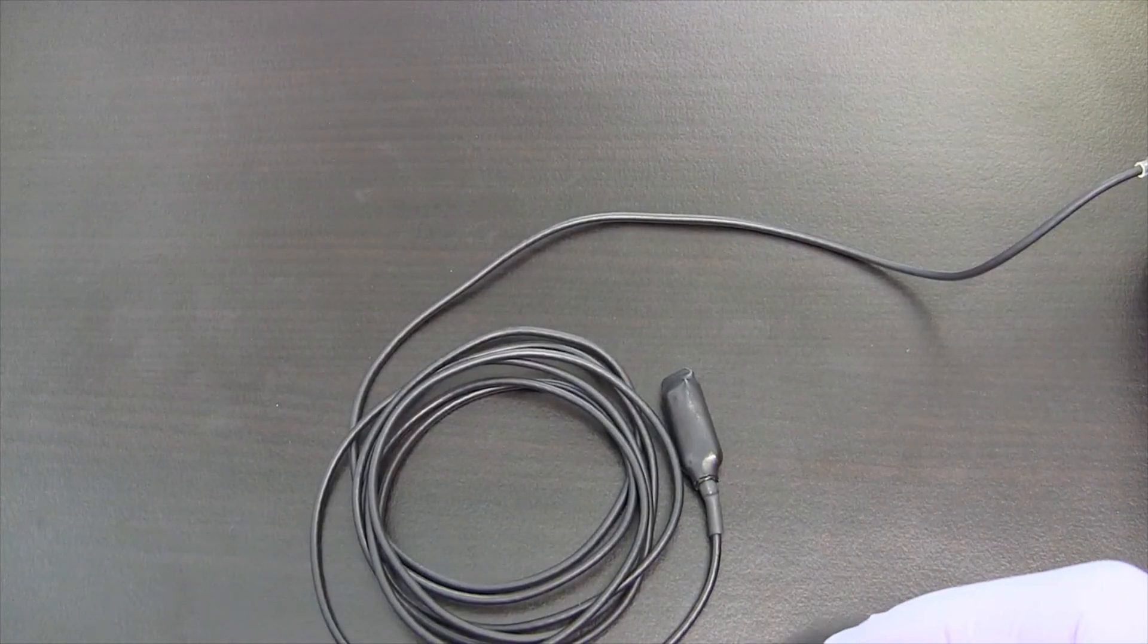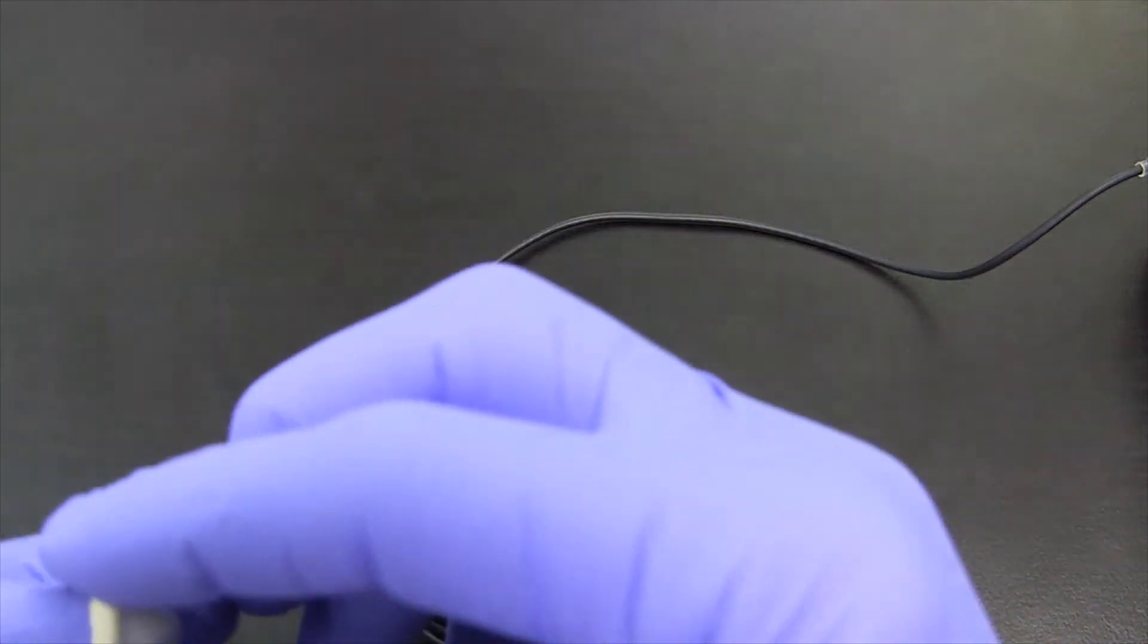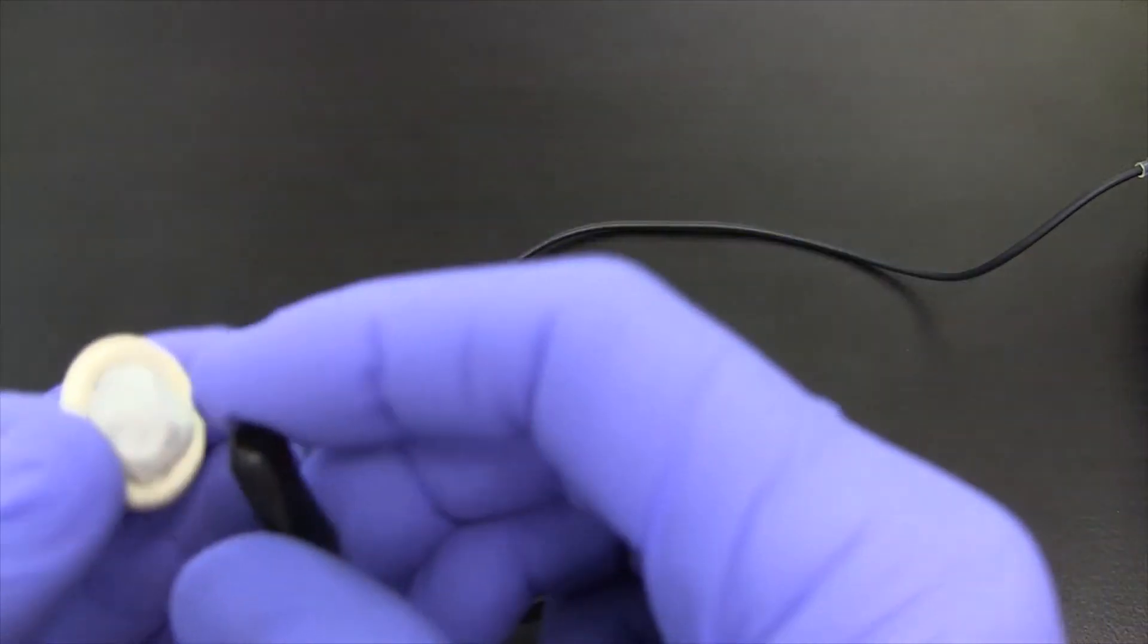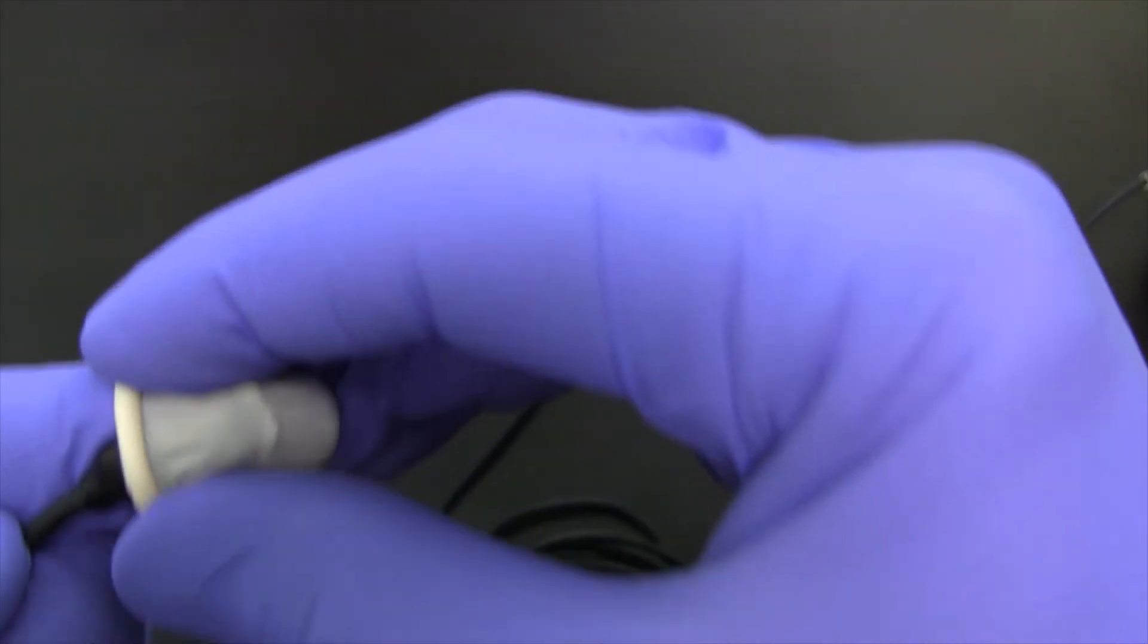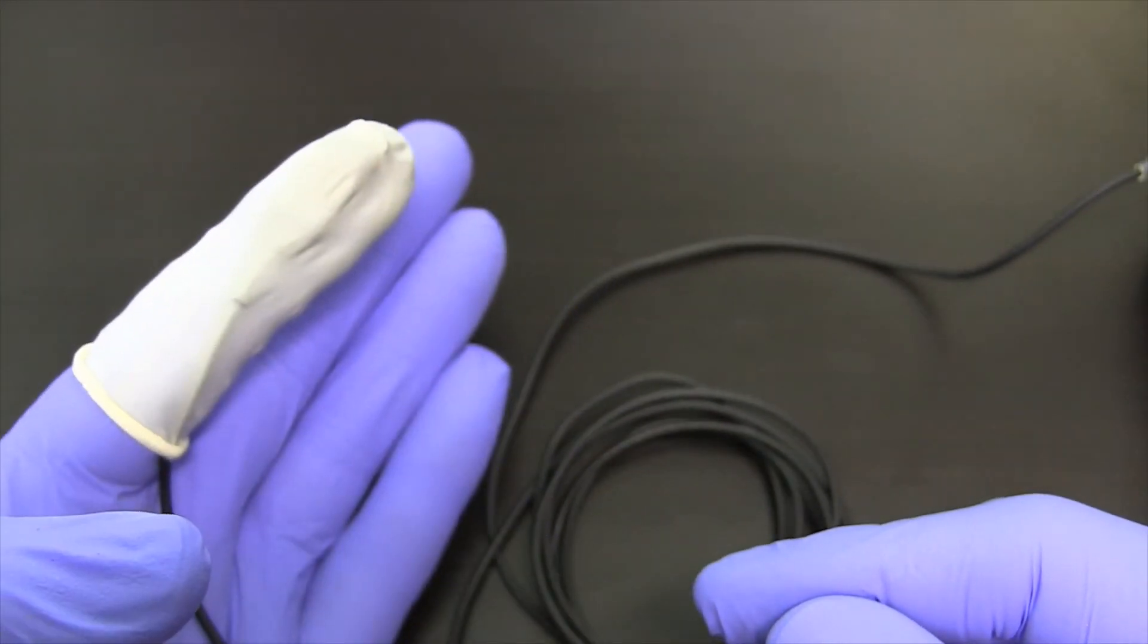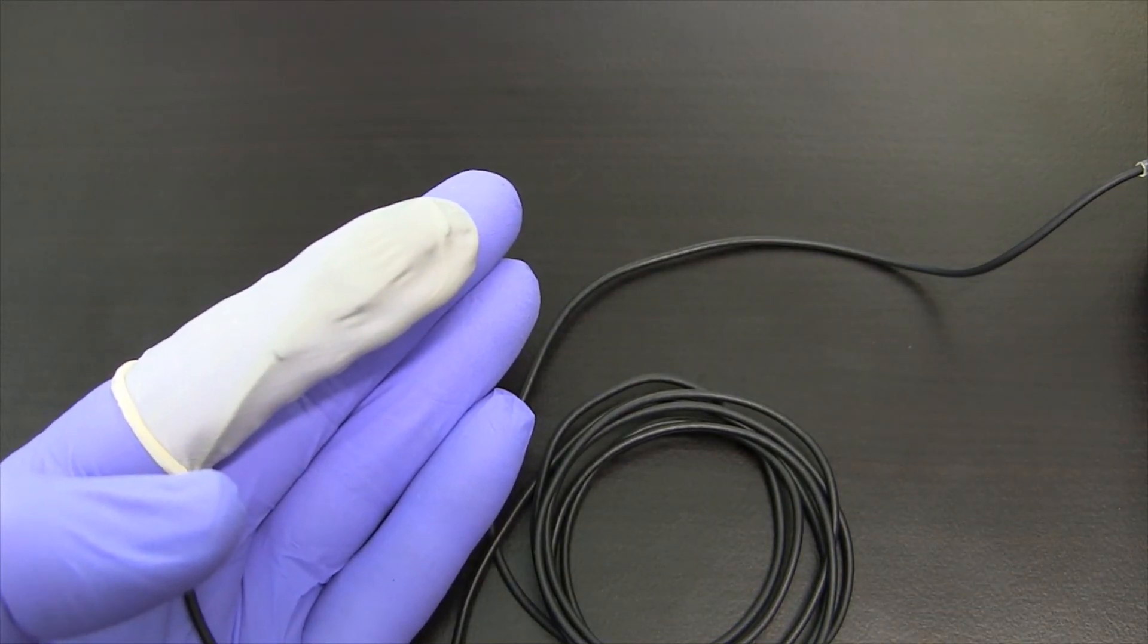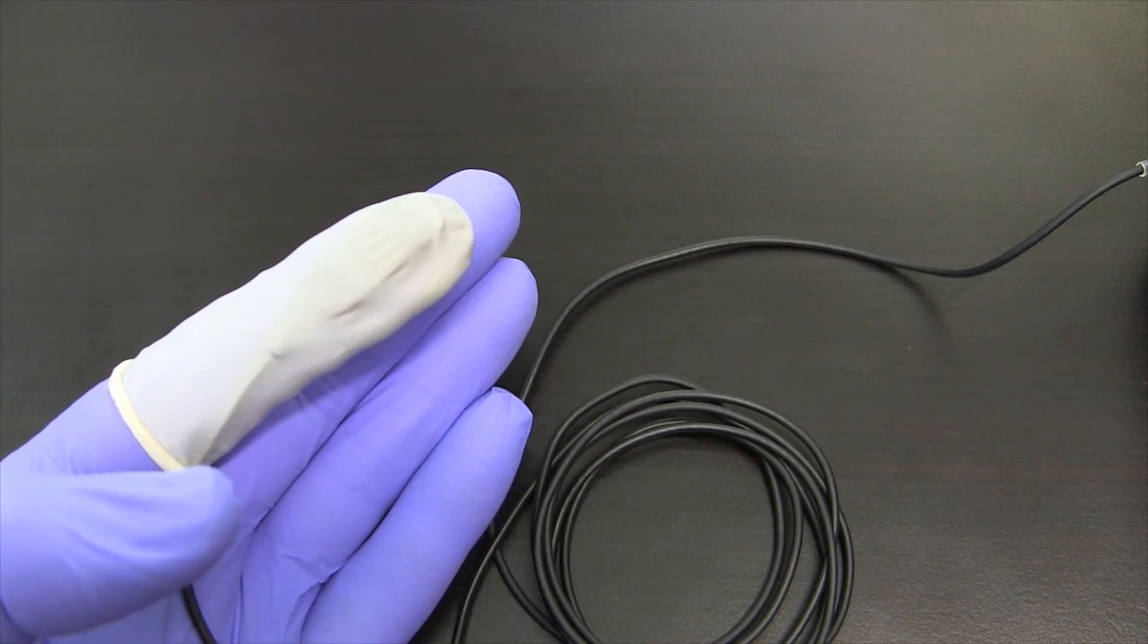There are several methods to mount the ED3 detector onto the fingers or extremities. One is the simple finger cot. By putting the detector on and then moving the finger cot over the finger, you can see how you can actually get the detector easily mounted. There are several other methods, such as using an elastic band. Some people will actually use surgical tape or other types of tape.